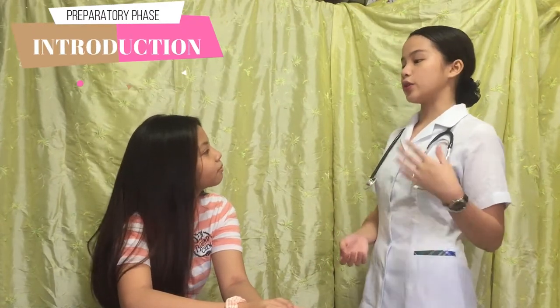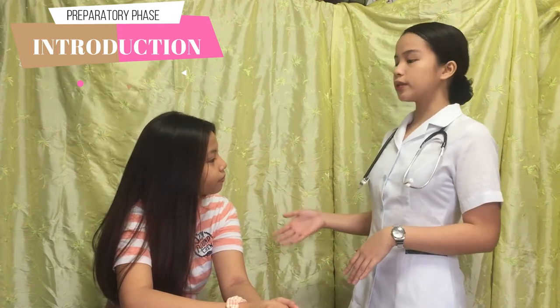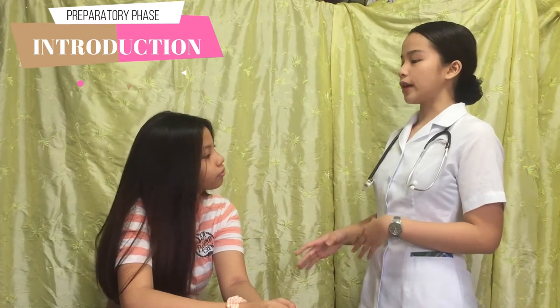Good morning. I'm Lindsay Malasik. I am Michelle De La Serna and I will be your student nurse for today. How would you like me to call you? Lindsay. Today we will be checking your blood pressure. This will serve as your baseline data and it will help identify any underlying heart conditions that may need immediate care. So is it okay with you? Yes.